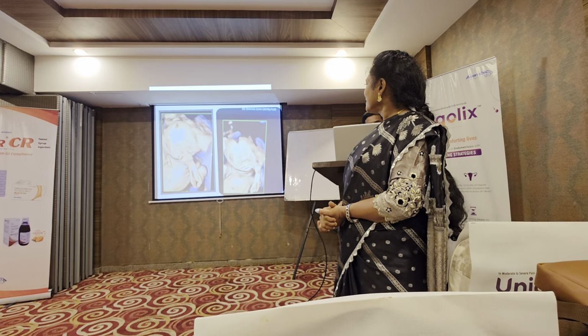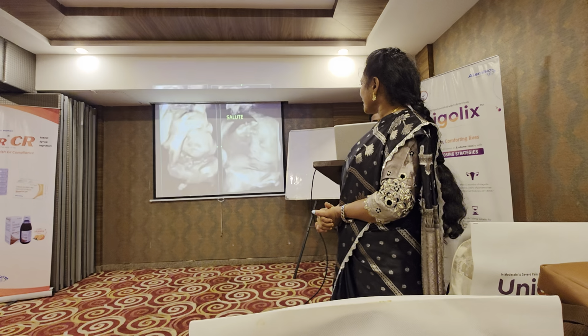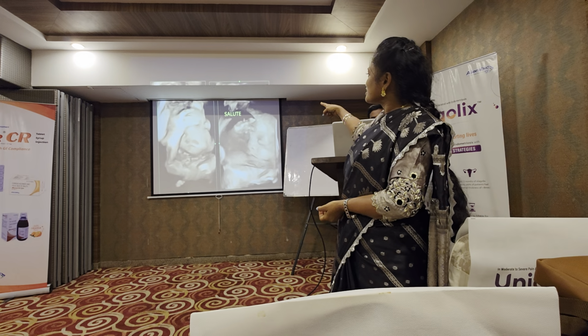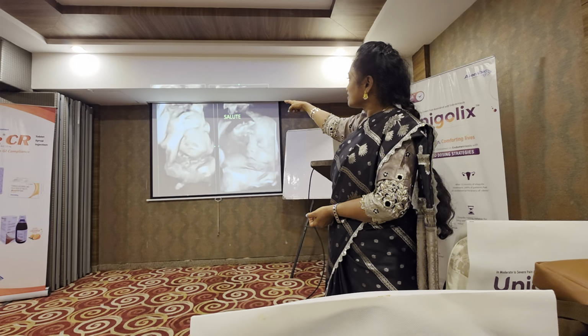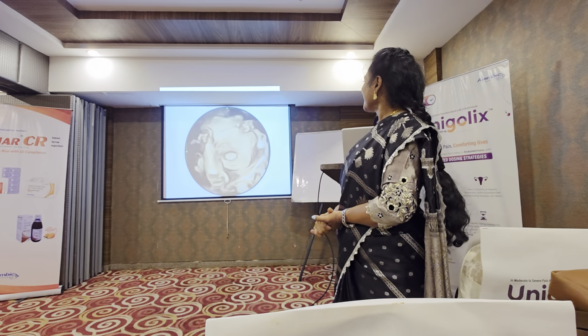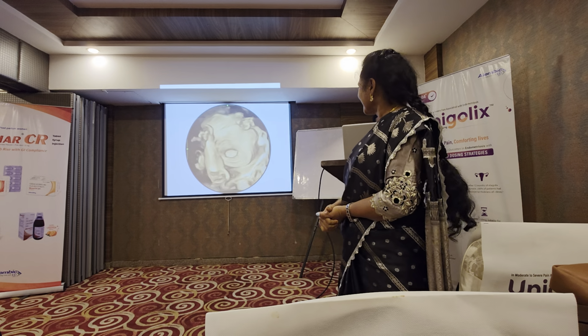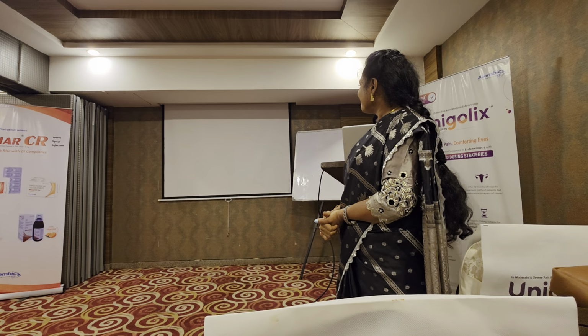Next one. Different poses, they're so nice to watch. Next one. So this baby was giving me a salute, and that baby was literally saying, "Why are you looking at me so many times?" Next one. This baby was yawning. Enough of scanning. Next one.